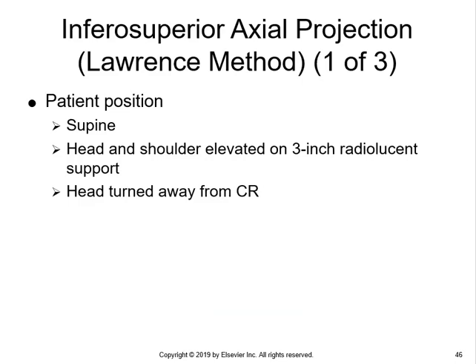So then we'll move on to the other Lawrence method, which is what a lot of people call the axillary view. You don't hardly hear anybody refer to it as the Lawrence method in clinical practice because Lawrence is pretty much all over the place in positioning textbooks. So to keep from having to clarify which Lawrence method that you're referring to, in a lot of cases people just refer to it as the axillary.